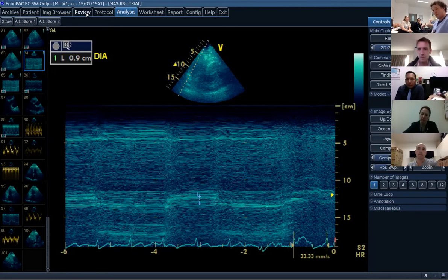Just a question. Yeah, go, Lee. My understanding is if you're going to do this assessment, you want zero pressure support as well, so you can actually see paradoxical movement. You want their inspiratory efforts. That way, as they generate negative intrathoracic pressure, you'll actually get paradoxical diaphragm movement rather than moving down like it's supposed to. Yeah, I think that makes physiological sense.